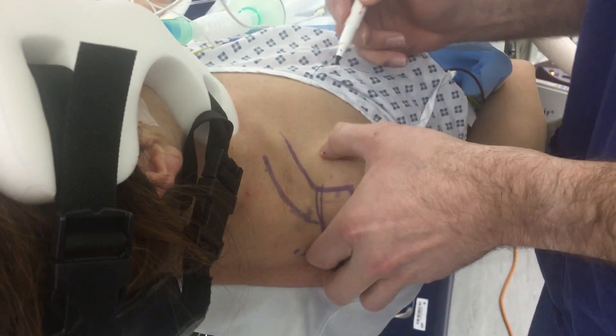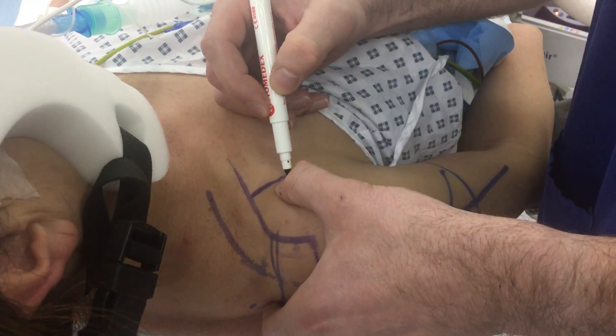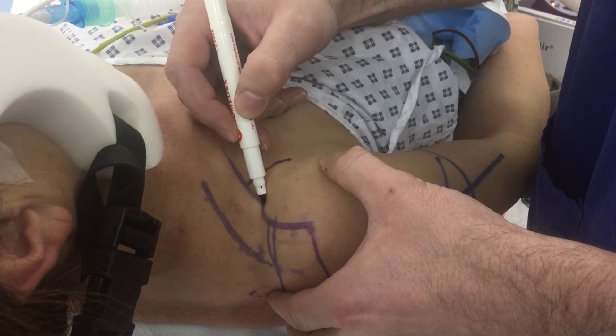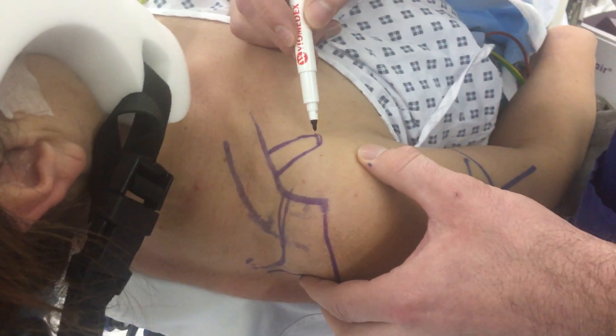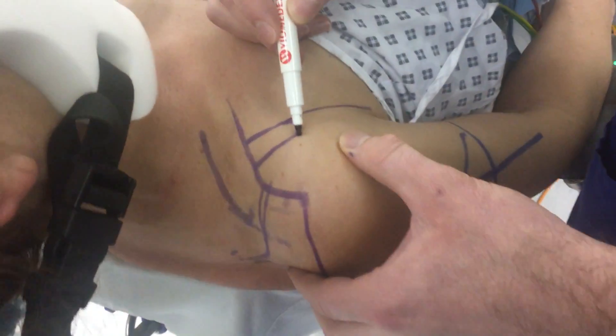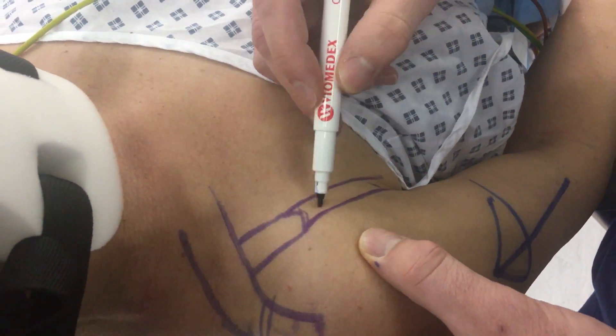At the front we then mark our coracoid, which is perpendicular down from the clavicle and the conjoint tendon. I like to mark it down as it heads towards the apex of the anterior axillary fold.